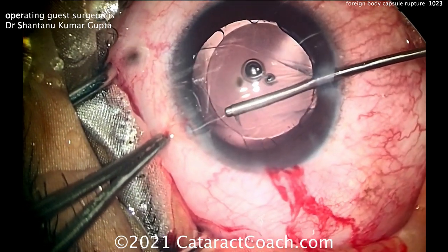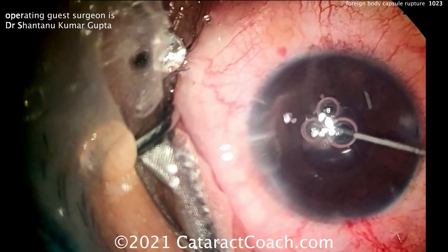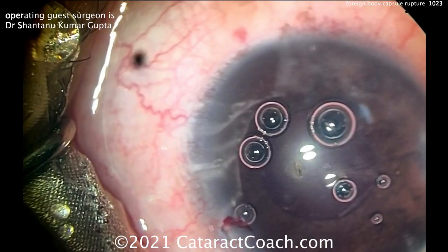Now he's going to adjust the capsular axis a little bit to get a nicer shape — this is a nice move but not really critical. Now sealing up the incision, and that looks pretty good.